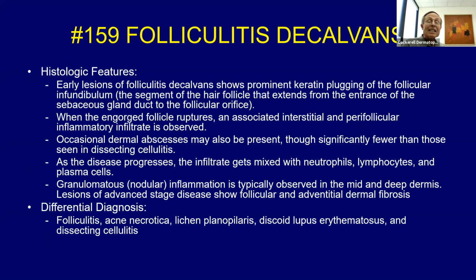Dissecting cellulitis, basically the same disease. So it's just another variant of that. Folliculitis and perifolliculitis capitis abscedens et suffodiens, that's basically the same thing. So there's a lot of names for this general process.